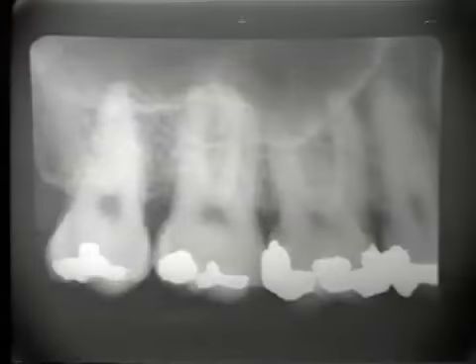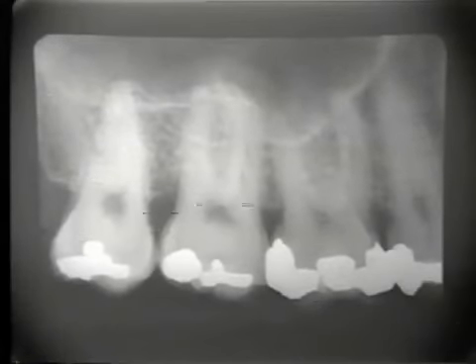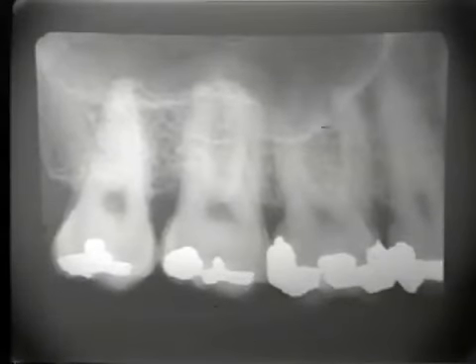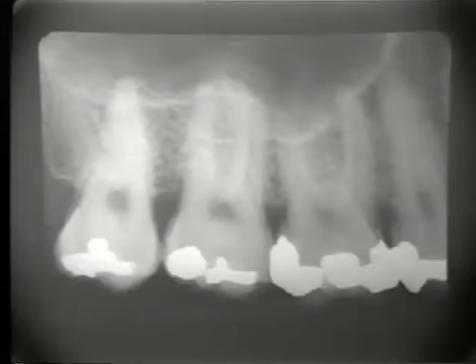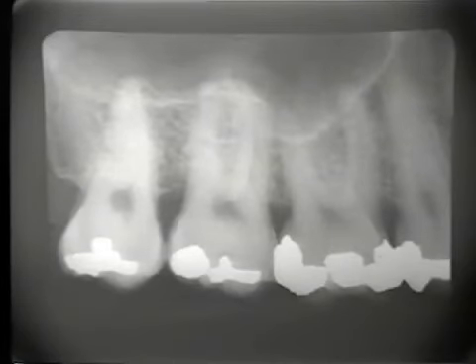The next region is that of the second and third maxillary molars. It also gives us another look at the first molar. We will endeavor to place the film with its anterior edge in the center of the second bicuspid. That will position the back edge of the film back far enough to include all of the third molar. We're again using the number 2 size film.